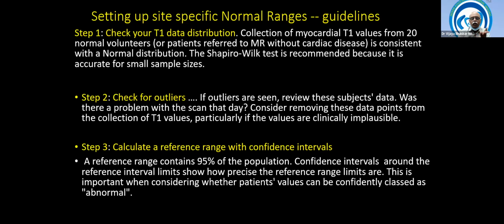Number one. Number two, after getting your normal value, the same method you have followed for the normal value has to be followed for your patients also for clinical diagnosis. Otherwise, you'll go wrong. The same values, same parameters have to be used. Similar standards have to be used. Same conditions have to be used. This is imperative, including the ROI. Very important.